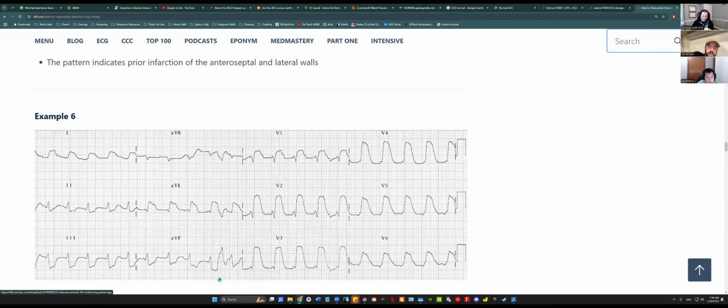Yeah, good. And like you said, you need to look for your baseline and then your changes from there. So it doesn't matter what it looks like. Looking for the baseline is really helpful, because it's like, oh, this is a total mess. Call the doctor.